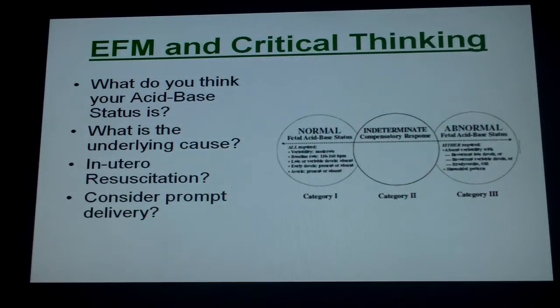Okay, one more review of your little chart here about your fetal acid-base status and your critical thinking. What do you think your acid-base status is? What do you think is the underlying cause? And we reviewed all the decelerations and what causes each thing. What would guide your in utero resuscitation?